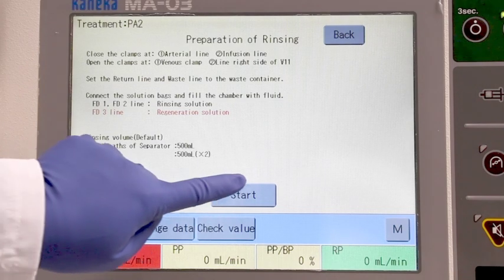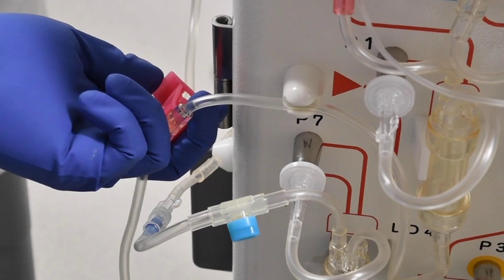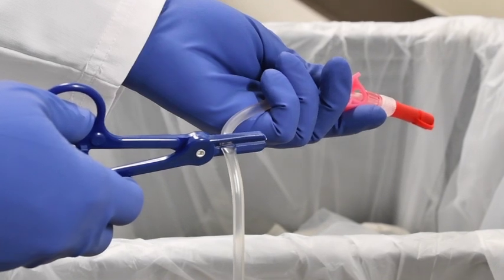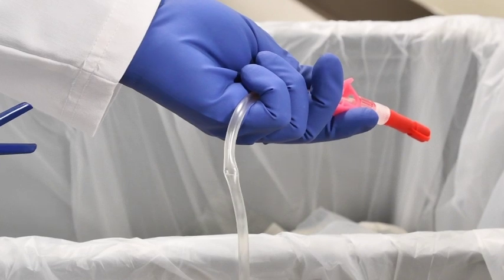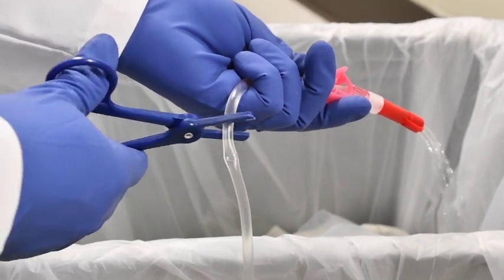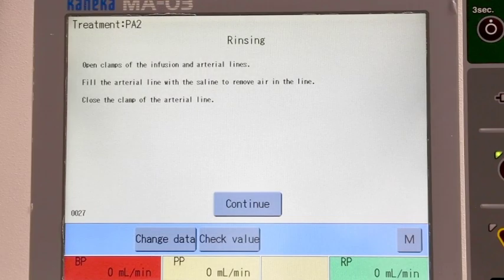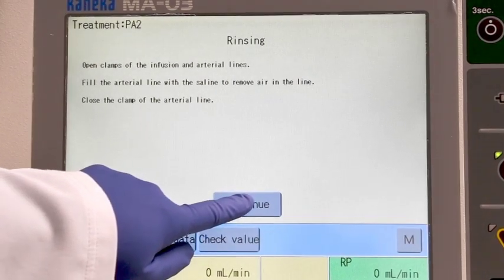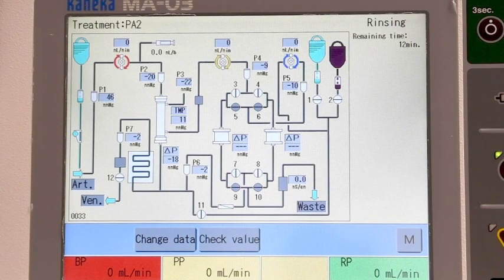Touch the start key. To purge air from the blood withdrawal line, open the blood withdrawal and infusion line red clamps. Back flush the blood withdrawal line with 0.9% sodium chloride. Clamp the blood withdrawal line only and hang back on the IV hook. Touch continue — the rinsing process starts automatically and takes approximately 12 minutes. When the rinse mode is complete, the buzzer will sound.